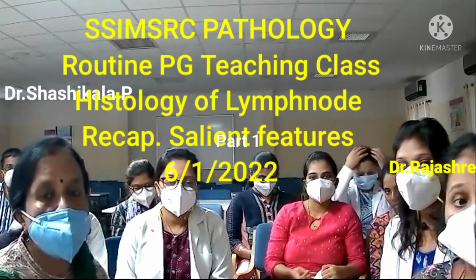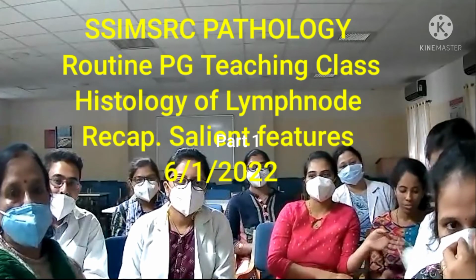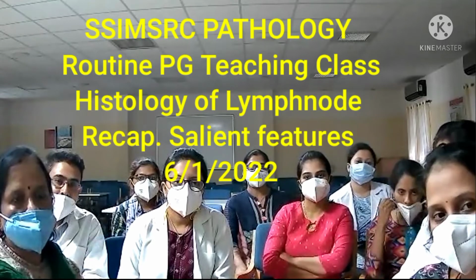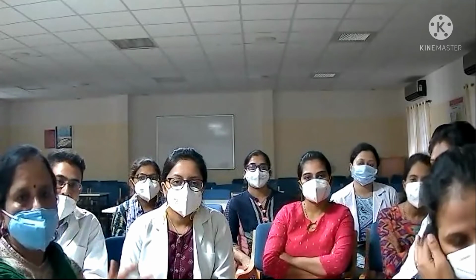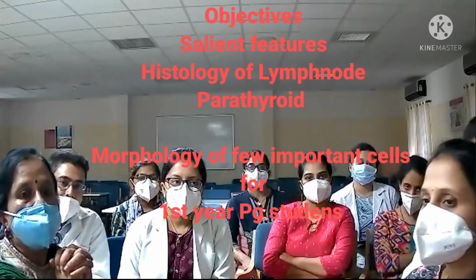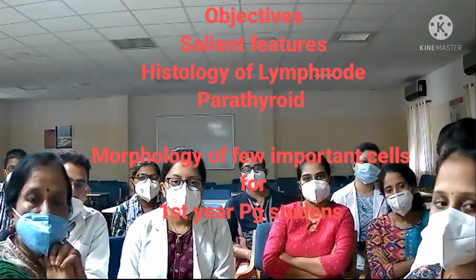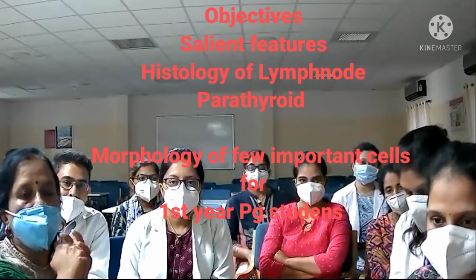Dr. Rajeshri is here, and she is going to show us some basic histological pictures. And of course, in continuity, there will be some pathology also. This is for the first year PGs, because she made them learn about the histology of lymph nodes. So we're not going into detail. This was already dealt with.